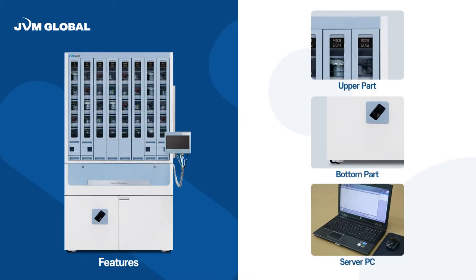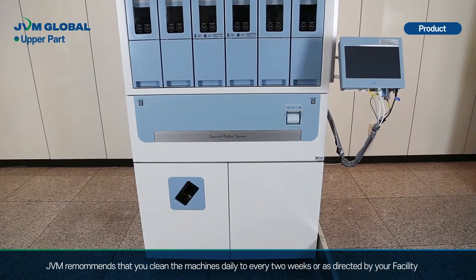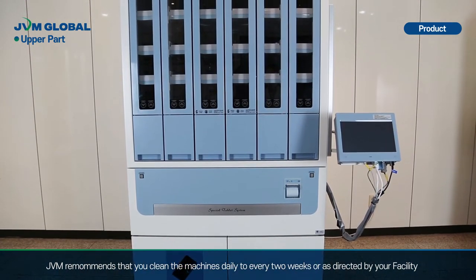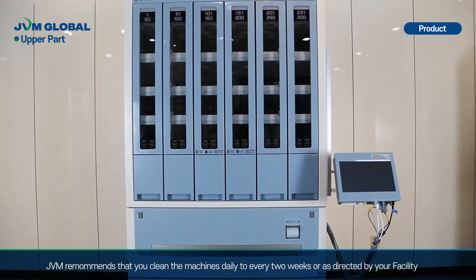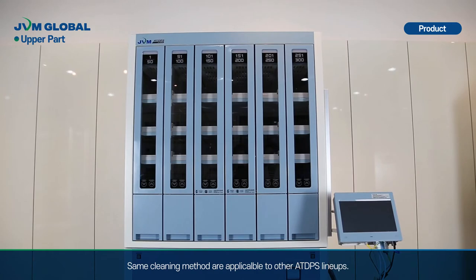Before we begin, let's look at the three major parts where we have to focus on cleaning: the upper part, the bottom part, and the server PC. JVM recommends that you clean the machines daily to every two weeks, or as directed by your facility. The same cleaning methods are applicable to other ATDPS lineups.